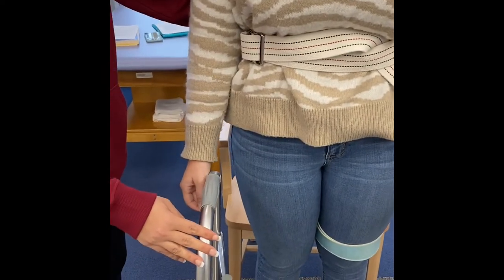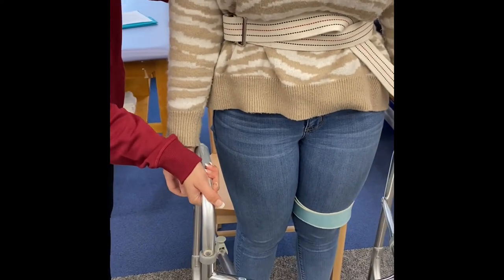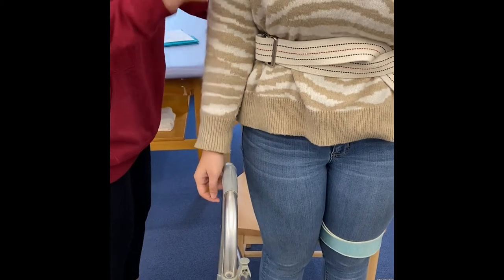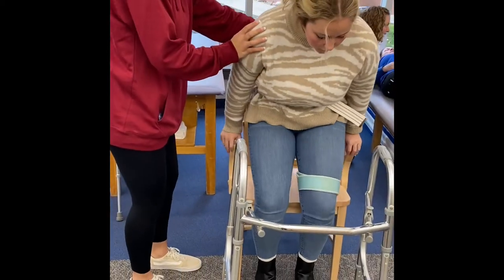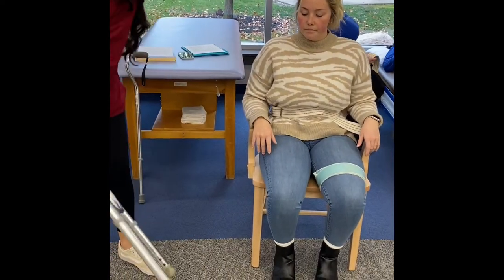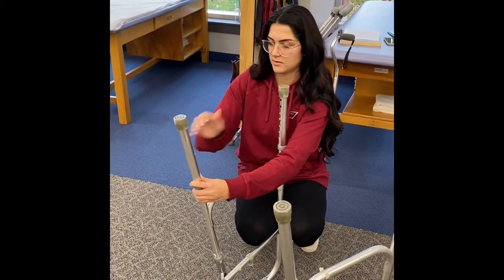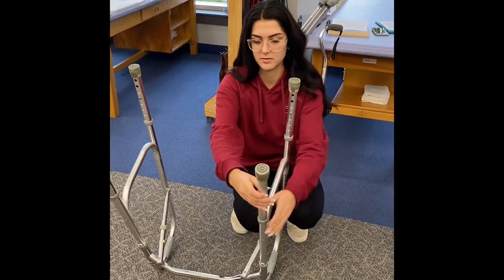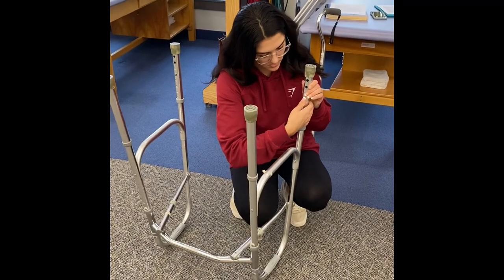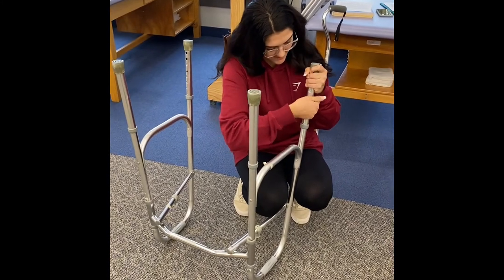Okay, it is a little short. I'll have you reach back to the chair for me, and I'll adjust this one. And then you can just wrap it up.